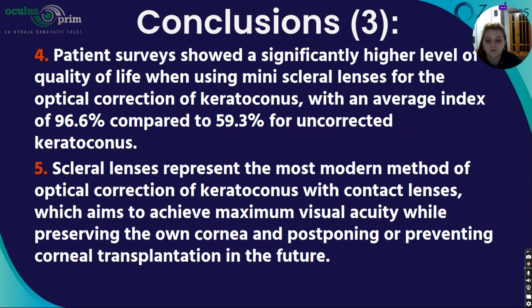Scleral lenses represent the most modern method of optical correction of keratoconus with contact lenses, which aims to achieve maximum visual acuity while preserving one's own cornea and postponing or preventing corneal transplantation in the future.